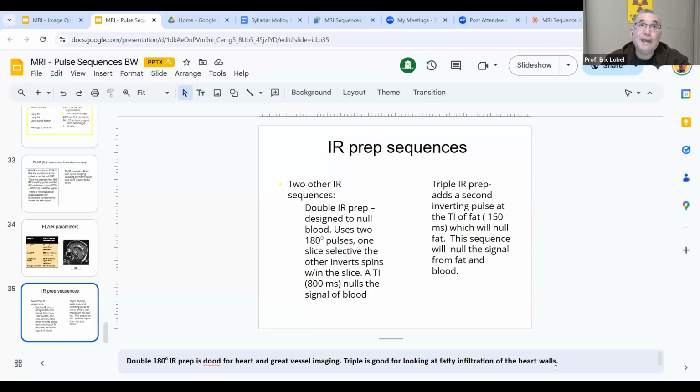And then at the end of the course, which is one of the more fun lectures to me, because it's kind of like newer versus older stuff when it comes to sequences like perfusion sequences, spectroscopy, and the big one that is on all the TV shows, fMRI, functional MRI.